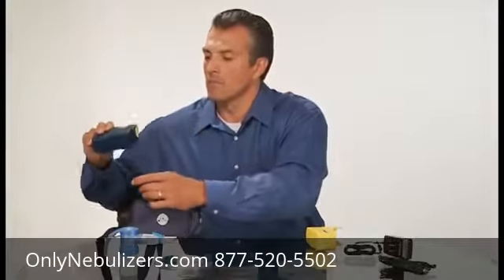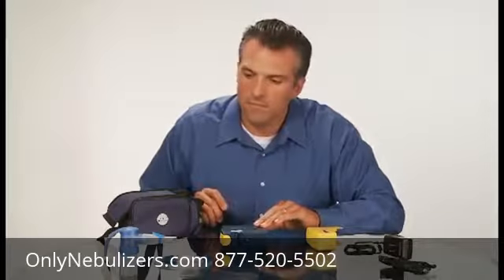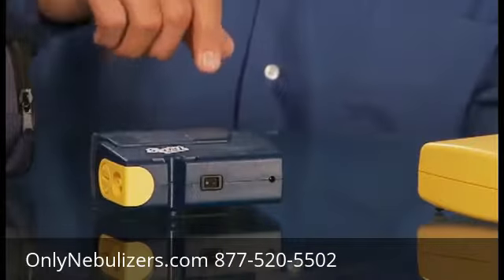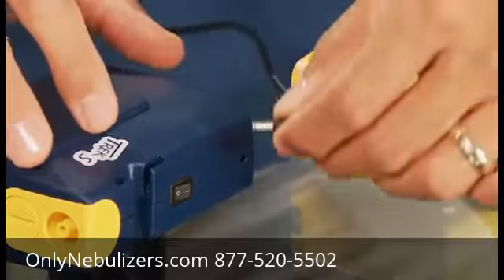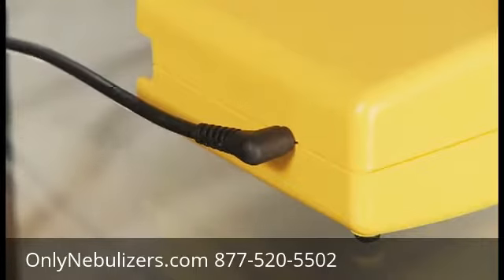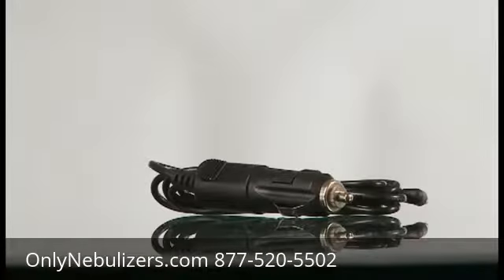Remove your Trek S from its packaging. Be careful not to discard any of the package contents. Place the Trek S on a flat, stable surface that is not cushioned or upholstered. Check to make sure that the power switch is turned to the off position. Your Trek S can be powered using one of three ways: AC adapter, 12-volt DC adapter, or with the optional lithium ion rechargeable battery. Plug the included AC or 12-volt DC adapter into the power receptacle on the Trek S or optional battery as shown here. The AC adapter should be plugged directly into a polarized wall outlet. Do not use an extension cord.